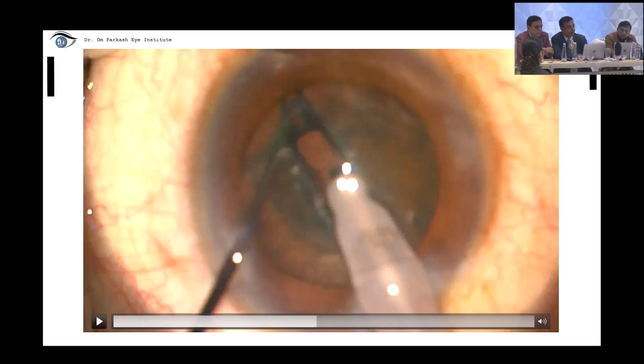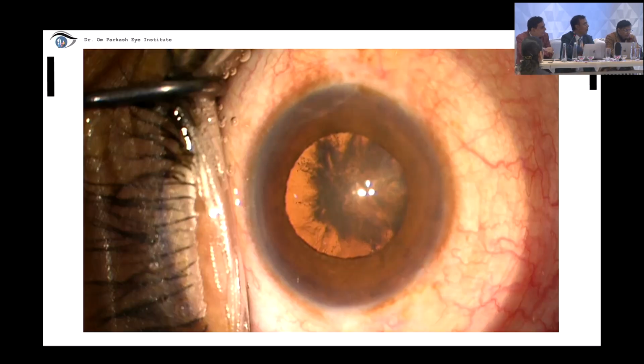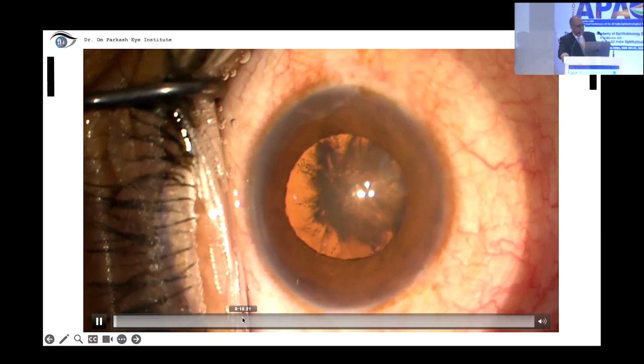And of course, an IOL scaffold, if you had a smaller piece, you could have brought it out of the bag and put an IOL scaffold. Absolutely. Rohit, 1 minute. Yeah, absolutely. Rohit? David, your take on it?